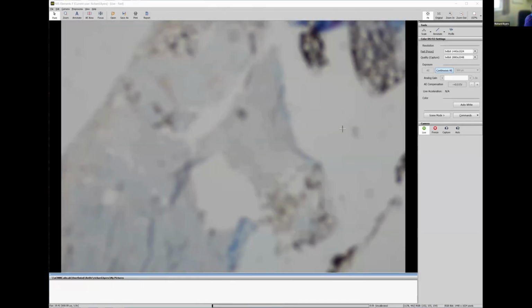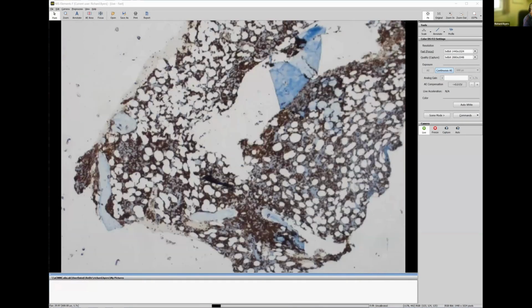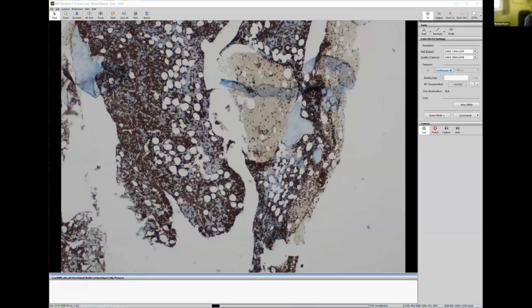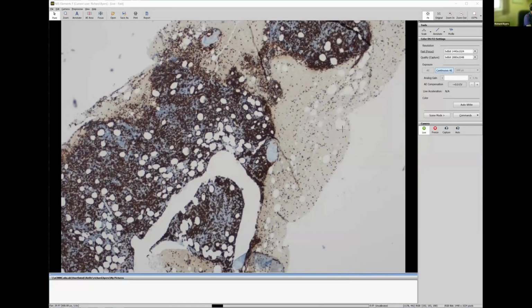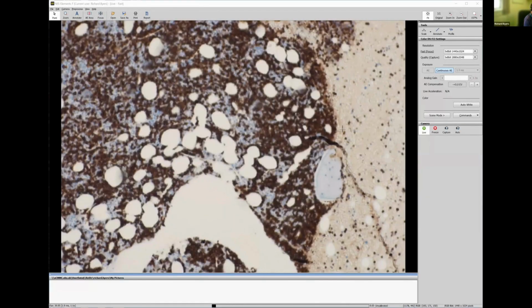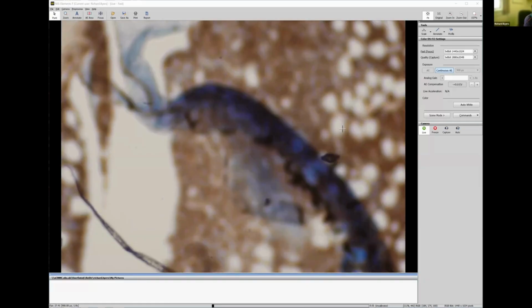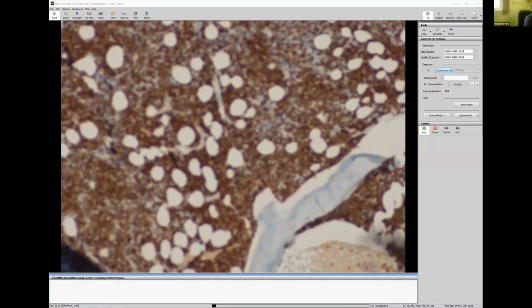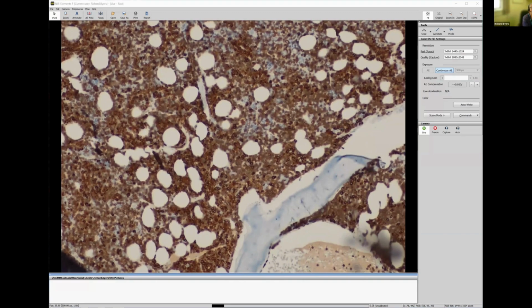So this was unexpected, and this is the CD20. You can see a very strong positivity for CD20. I think I estimated about maybe 60% of the cells positive for CD20, certainly in this area here, a very high percentage. And they're also positive for CD79A. I think there's slightly more positivity for 79A because obviously this also includes the plasma cells.